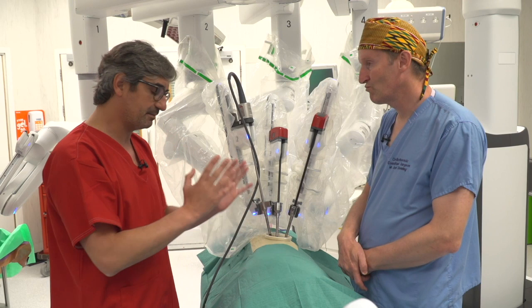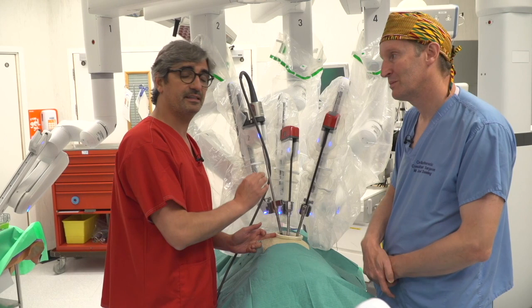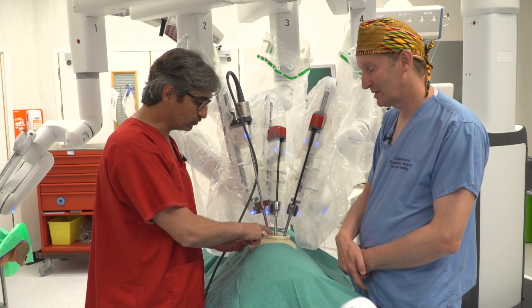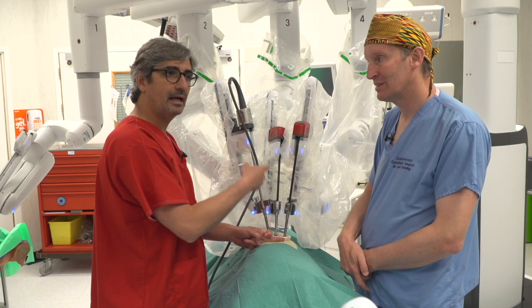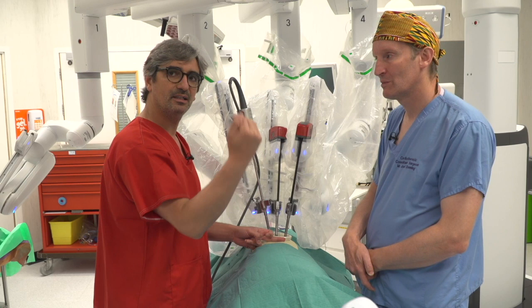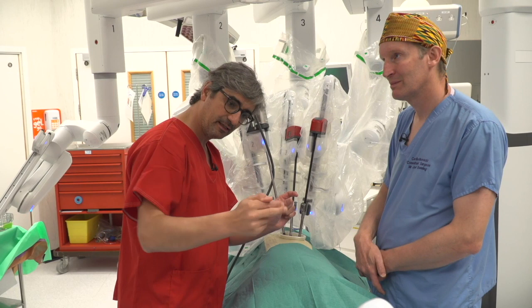And for this kind of pure RATS, the incision cannot be at the same place as uniportal VATS. We normally place it at the 5th intercostal space for uniportal VATS. But now with pure RATS, the incision should be lower. Normally at the 7th intercostal space. Why? Because if you put the incision at the 5th intercostal space for a right upper lobe, when you are going to put the robotic staplers, you do not have enough angulation to reach, for example, the vein or the artery or the fissure, which is in front of you. So you need a minimum length to allow the robotic stapler to go in and rotate with freedom.